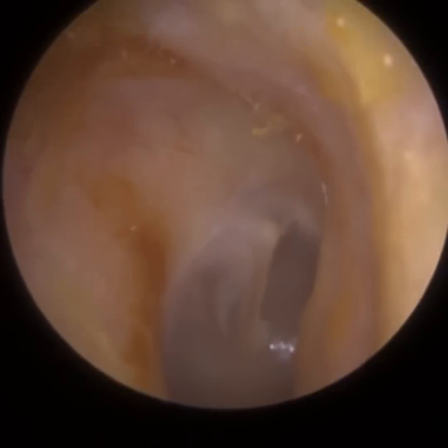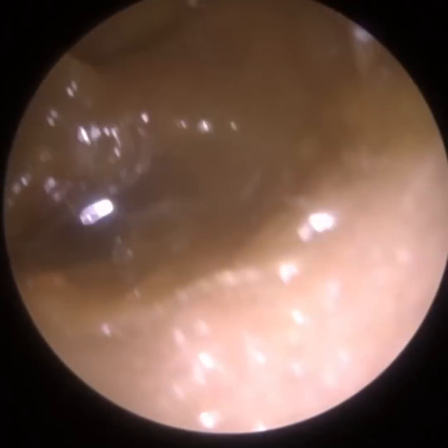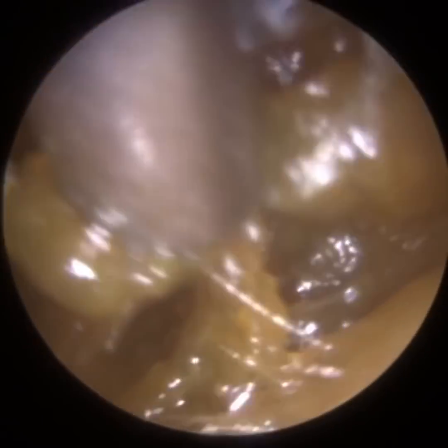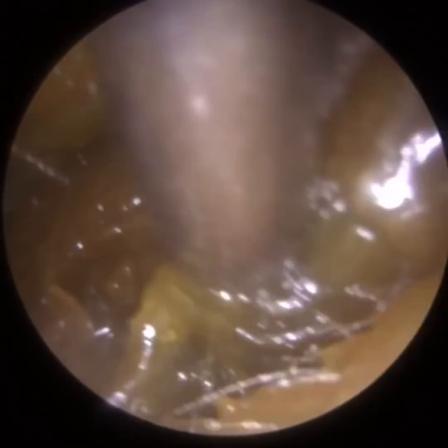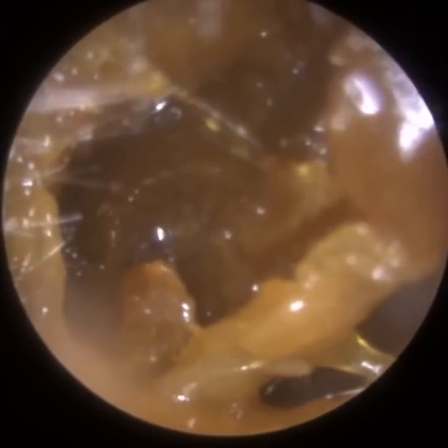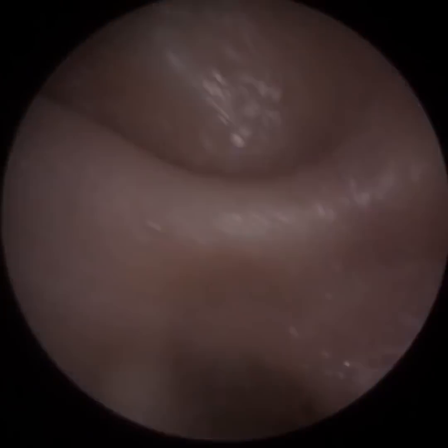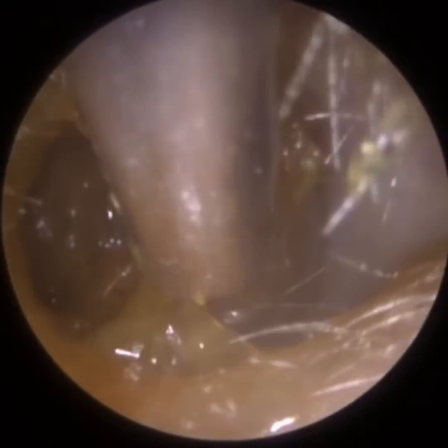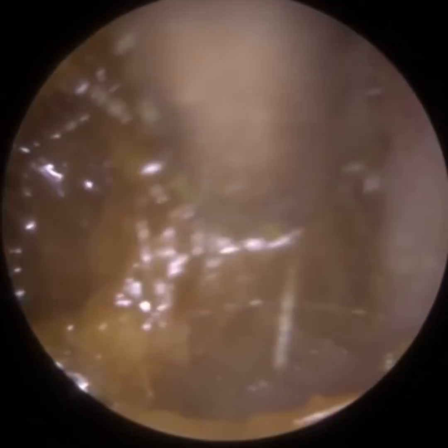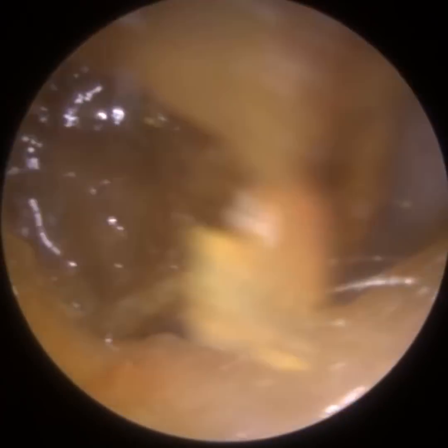Eardrums are nice and healthy. You'll see some staining around the edge. That's not important. A bit of wax is good for you. Again, I explained to our Clear Wax delegates yesterday, I stressed the point, less is more, especially when you're training and learning and building up your skill level. Just try to alleviate the patient of their symptoms. Once you get a bit more experience, when you know you can remove a bit of wax here and there without adding any additional risk, then that's fine. But initially, I always stress to the delegates, don't overdo it.